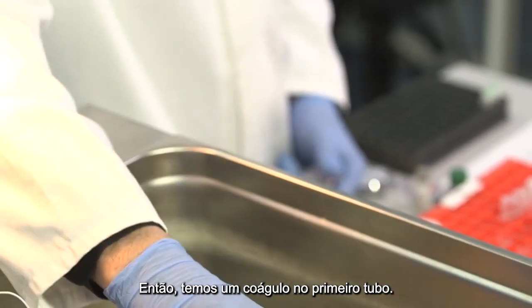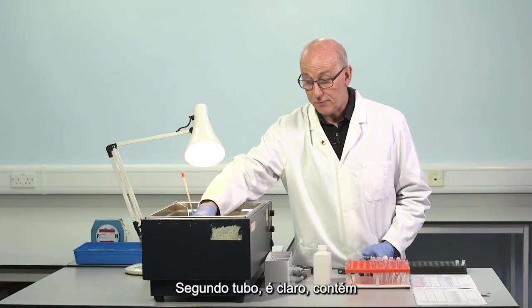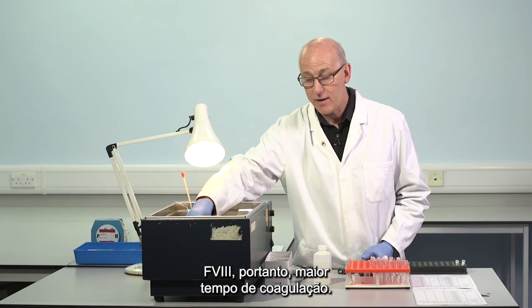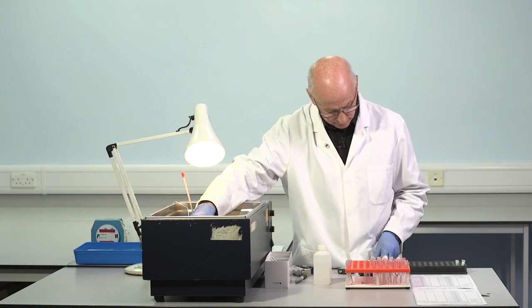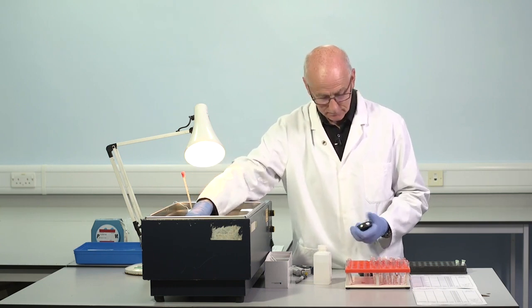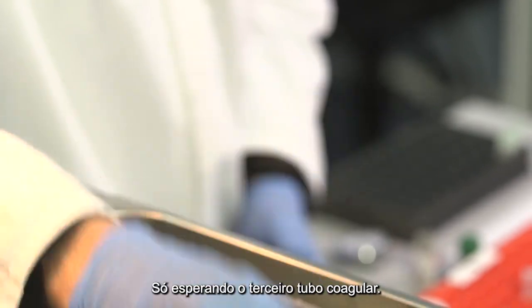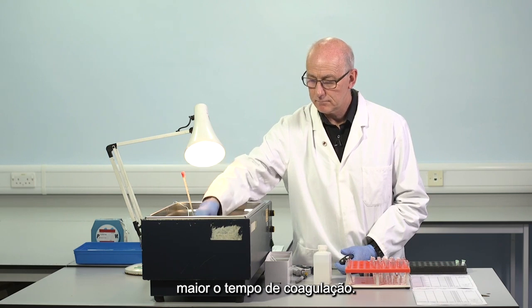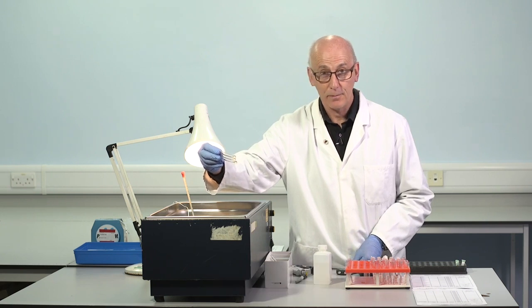So we have a clot in the first tube. The second tube, of course, contains a higher dilution, therefore less factor VIII, and therefore a longer clotting time. Just waiting for the third tube to clot. Lowest level of factor VIII, longest clotting time. So we've now got a clot in all 3 tubes.